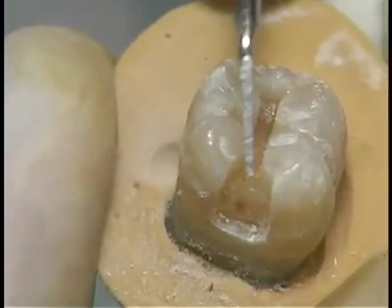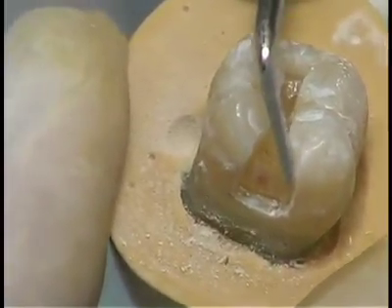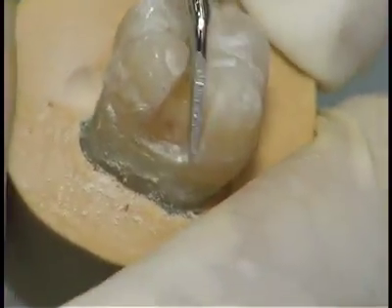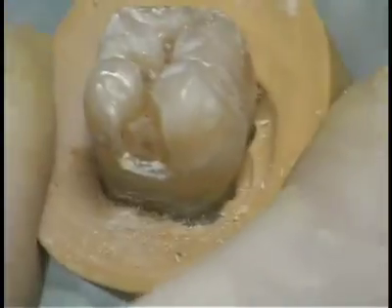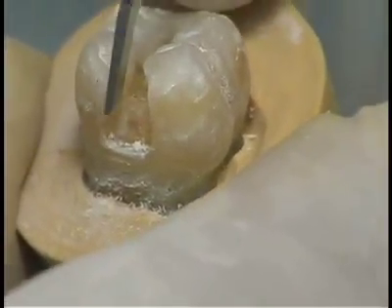At the buccoaxial line angle, carefully remove any ledges. Do the same for the linguoaxial line angle and the axial wall.